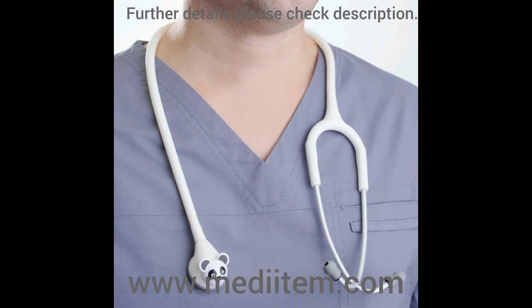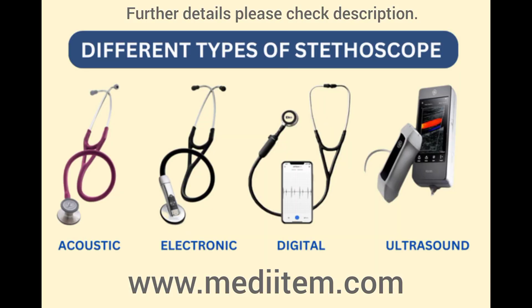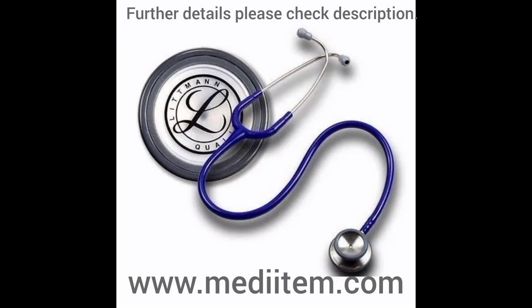This stethoscope is suitable for various medical settings, offering clear sound quality for accurate auscultation during examinations. Its reliability and ergonomic design make it a top choice for healthcare professionals at different stages of their careers. For further details, please check the description.